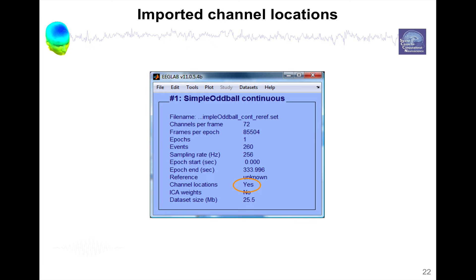So then you press OK. And now if you look at the interface in front of channel locations, it says yes, these channels have been imported.